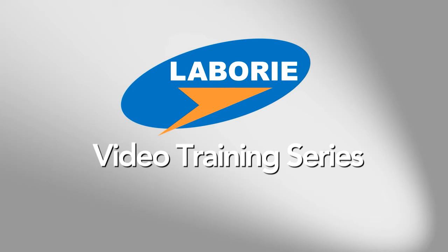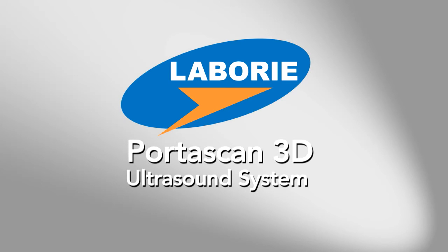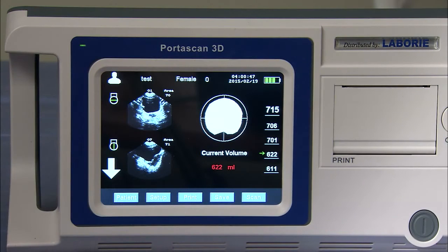Welcome to the Laborie Video Training Series. In this installment, we will demonstrate the Portascan 3D Ultrasound System. I'm Mark Sapsford with Laborie Medical Technologies. Today I'll be showing you the Portascan 3D Ultrasound System.